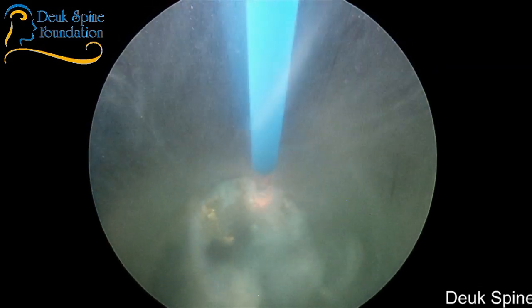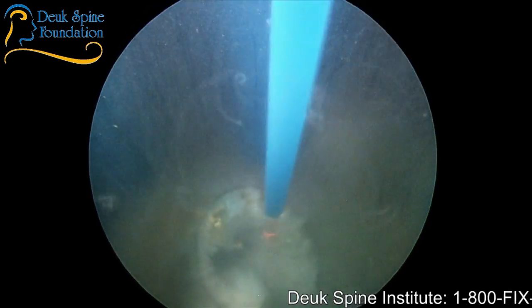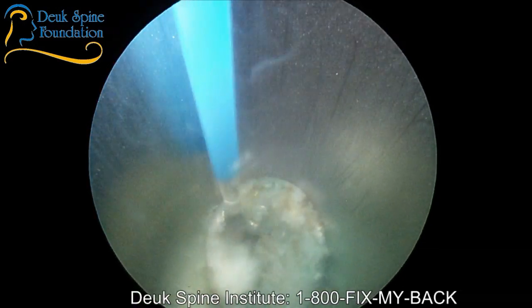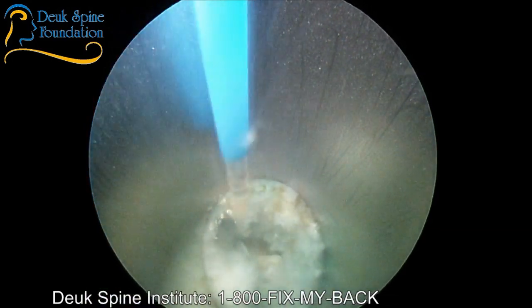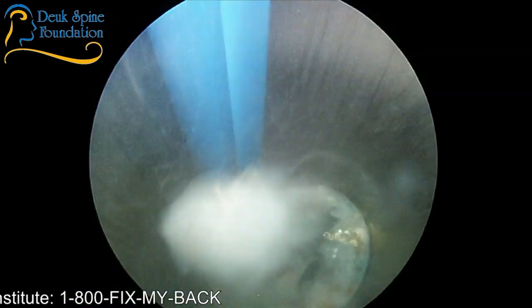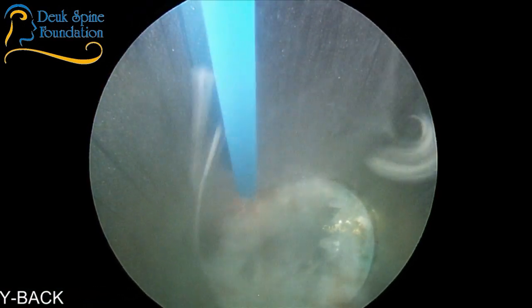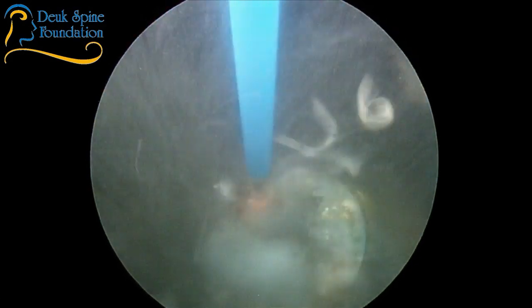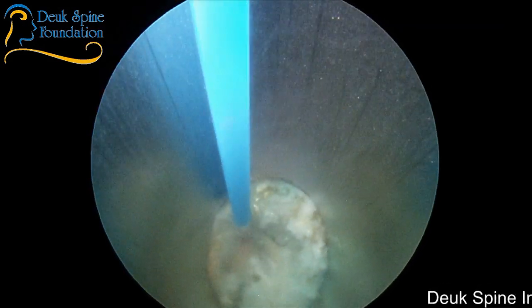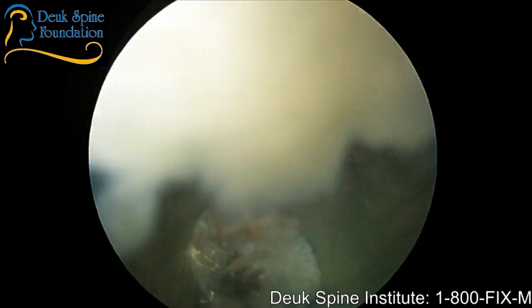So this has been a condition going on for a while. There's also some soft disc here that's a little bit easier to deal with the laser. But the older the injury, the harder it is in terms of scar tissue and calcification. The body tends to scar and then calcify damaged tissue. So whenever you see scarring and calcification, you know that that injury has happened sometime in the past. The more scarring and calcification there is, the older the injury. That's especially true with these discs that I fix. So there's a tear right there. You can see the tear. It's been going on for a long time.